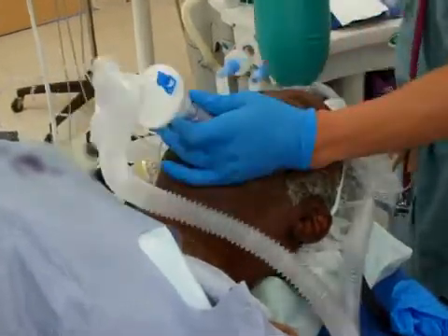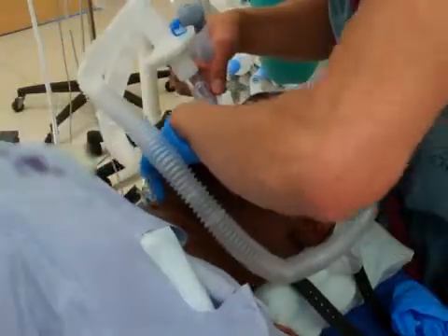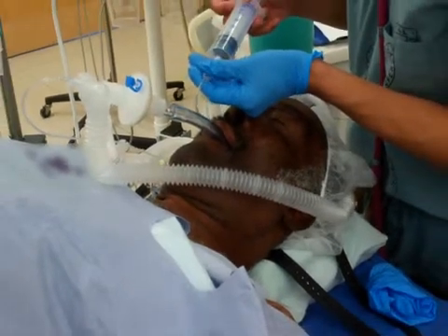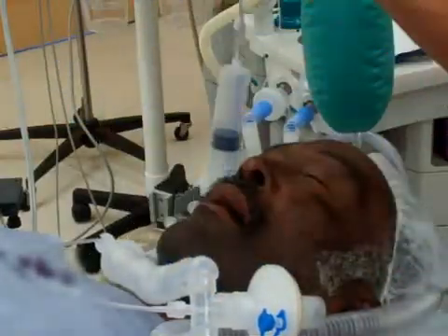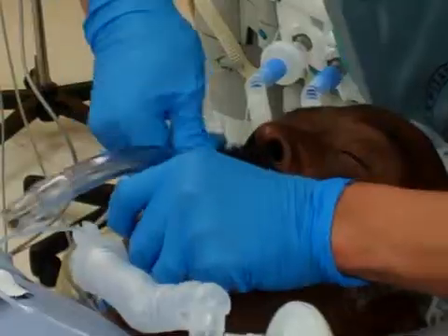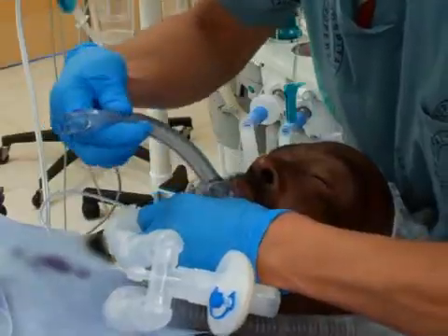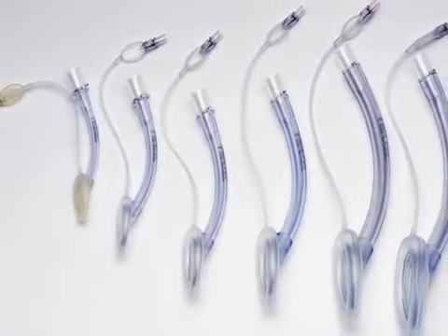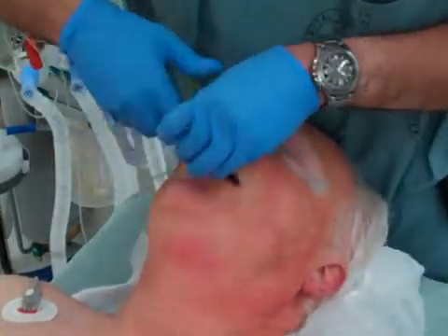Improper placement of the laryngeal mask airway can result in a poor seal or obstruction of airflow. If air leaks from the mouth or you do not achieve adequate ventilation, add an additional 5 to 10 milliliters of air to the cuff. If that fails to improve ventilation or decrease the air leak, gently remove and reinsert the LMA. If ventilation is still not achieved or there is a large air leak, attempt placement of a larger LMA. The most common obstruction occurs at the oropharynx, either because the epiglottis has folded down or because the tongue or redundant oropharyngeal tissue is pushed into the airway. Proper size selection and insertion technique will reduce the frequency of these problems.